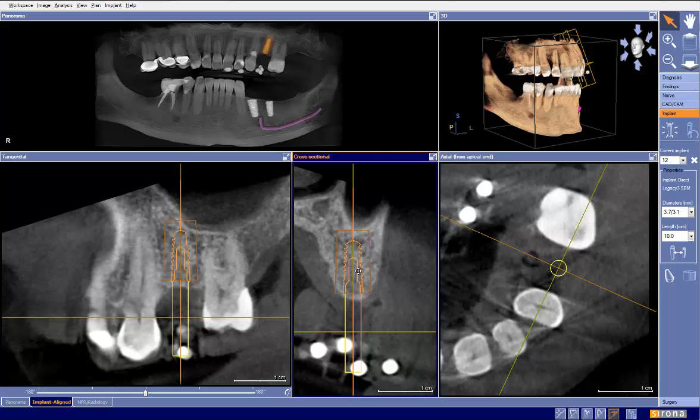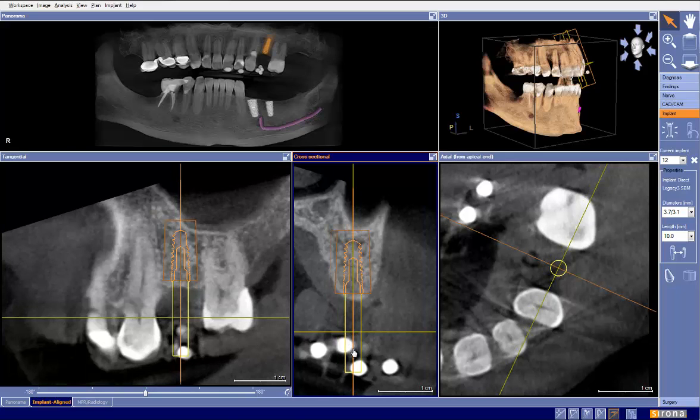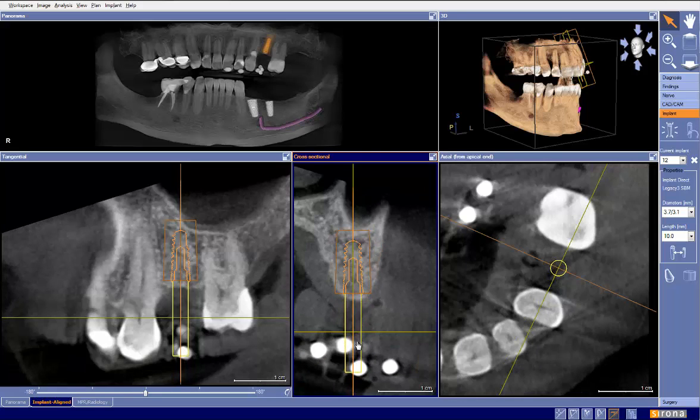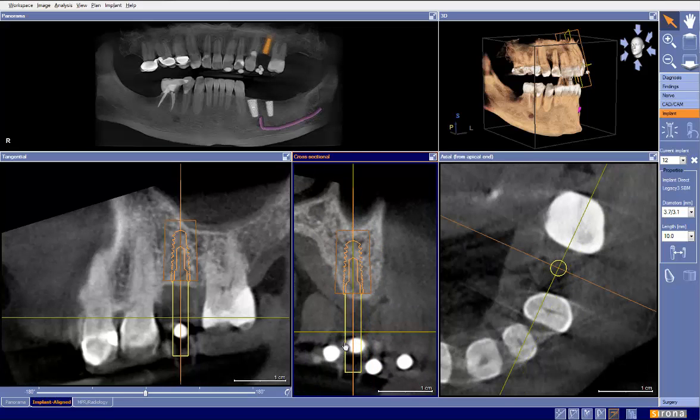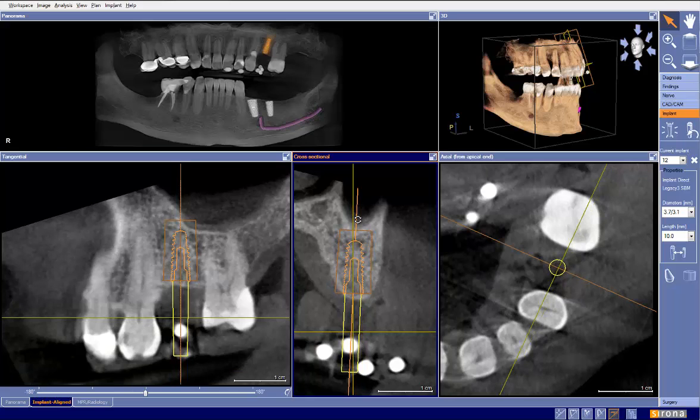Well, we can bodily move the implant back till we get in the middle, but then we have this issue. So the more logical option here is to tilt. Now we can tilt that forward to get in the right spot, but then we've left this very thin. We could again tilt just the platform of the implant over, but again then we've left this thin. So our option in this case is a combination. Let's move a little bit from the platform and a little bit from the apex.